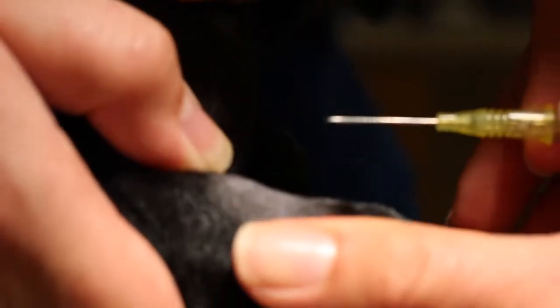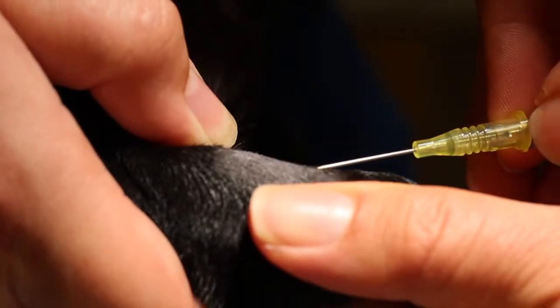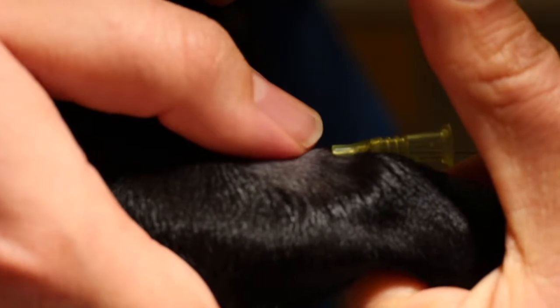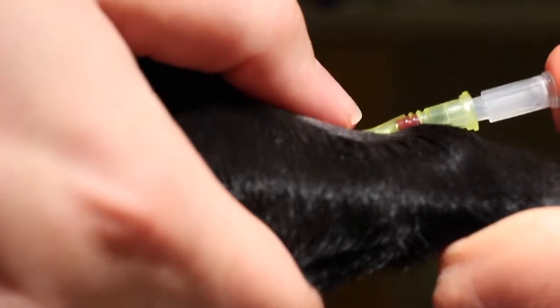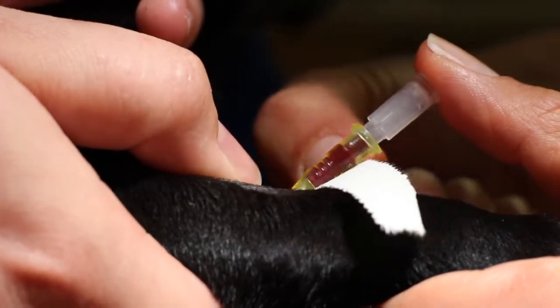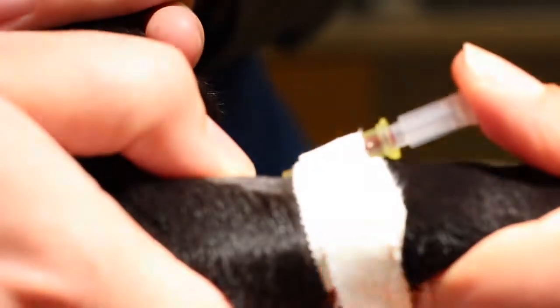Here you can see the angle of insertion of the stylet. It goes into the vein and then parallel down to the dog's leg as the catheter is advanced. A temporary plug will be placed here. The half strip of tape, sticky side up, is wrapped completely around the catheter so you have a good fixation of tape to the catheter and then tape to the leg.